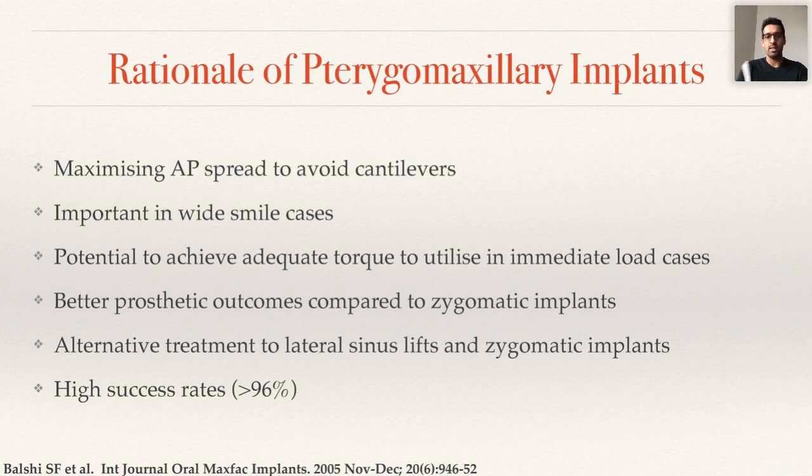Also, one great advantage of pterygoid implants in comparison to zygoma implants is that the prosthetic outcomes are better, but that is certainly dependent on the technique that you utilize to place zygoma implants. Traditionally, they were very palatal, but more and more we've become aware of that, and we're certainly moving towards a more restoratively driven surgical approach when it comes to zygomas as well. But generally, we can get better prosthetic outcomes with pterygoids compared to zygomatics.